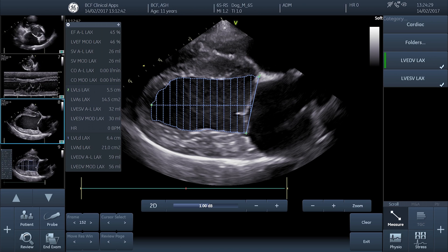We now have two values: left ventricular volume at end diastole and left ventricular volume at end systole. Taking the end systolic volume away from the end diastolic volume gives the volume of blood ejected from the ventricle during systole. Calculated as a percentage of the original diastolic volume, that gives us ejection fraction as a percentage — shown at the top of the screen as LVEF, left ventricular ejection fraction.